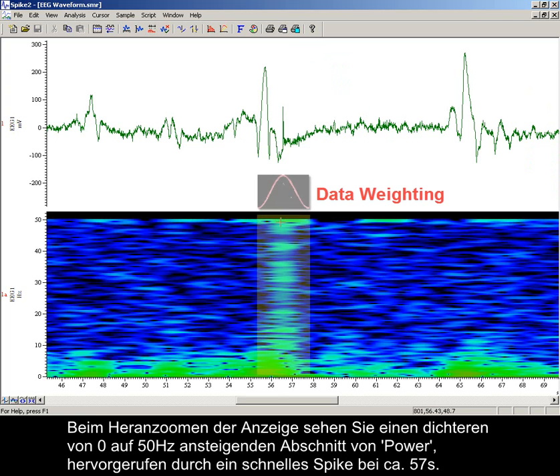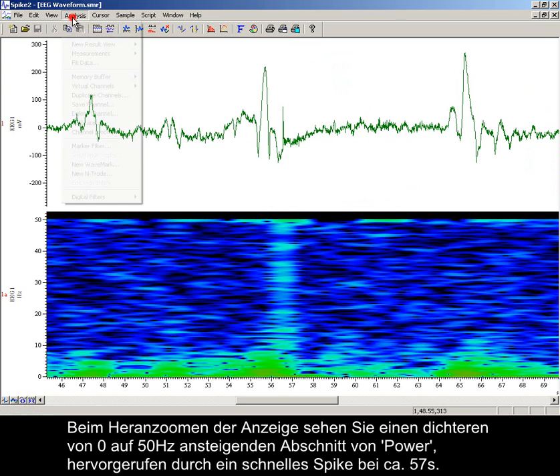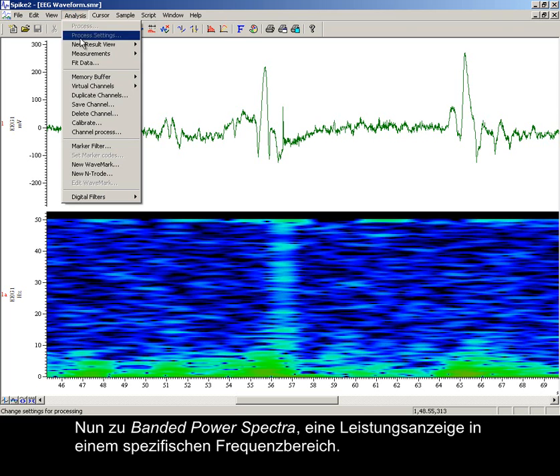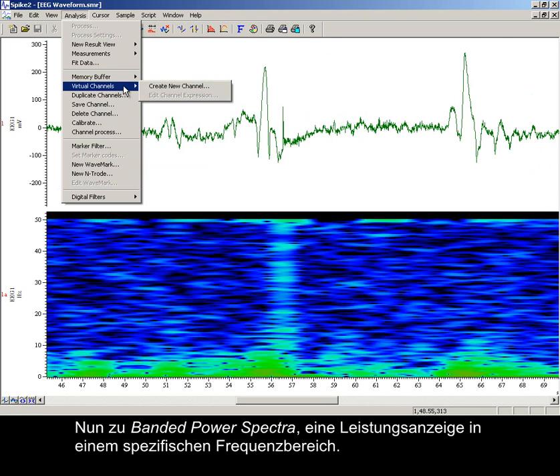The sonogram is made up of slices of power spectra. As we zoom into the display, you can see a denser section of power rising from 0 to 50 Hz, caused by a fast spike at around 57 seconds. Now to banded power spectra — a display of power in a specified frequency range.